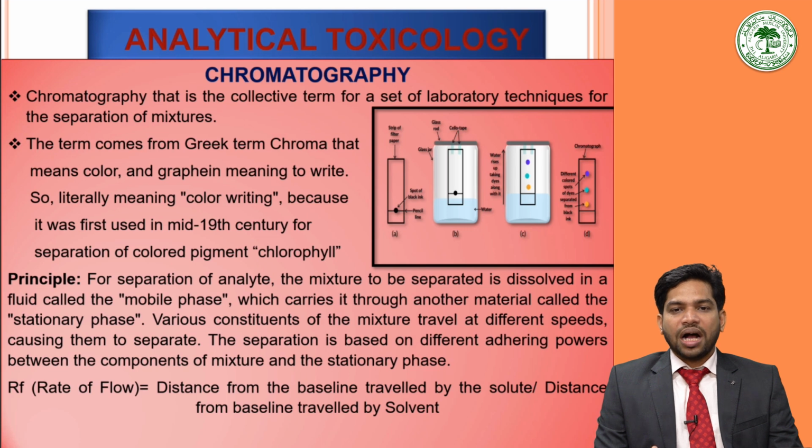The Rf value of the solute is more if it flows farther. Rf, that is the rate of flow, is the distance from the baseline traveled by the solute divided by the distance from the baseline traveled by the solvent.